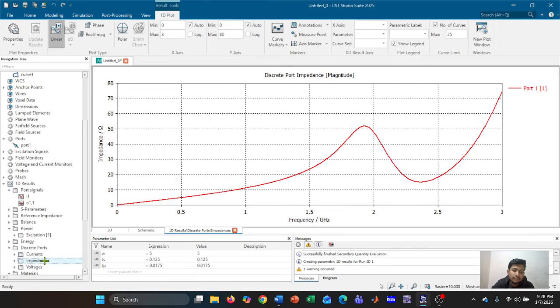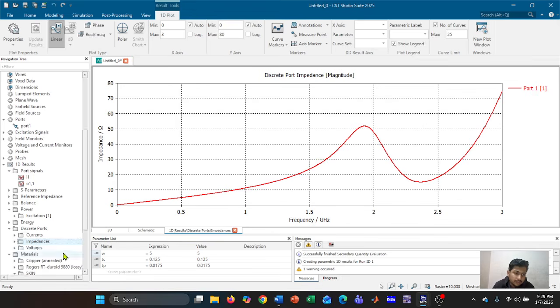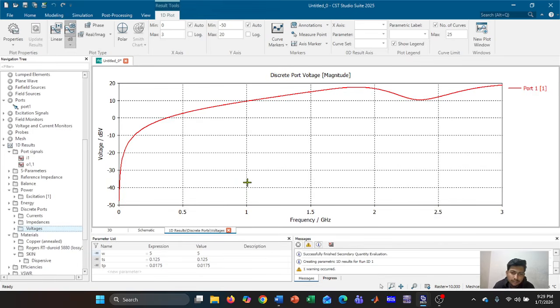If you see the port impedance, this graph shows how the antenna's resistance changes with frequency. This value changes because the antenna is inside the human body. Human tissues change antenna impedance and it's expected. And if we see the voltage at the antenna input over time, the voltage increases and then smoothly decreases after some time. Again, there are no sudden spikes, meaning safe electrical operation.